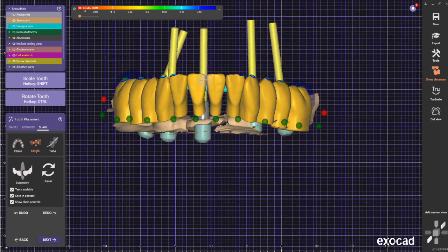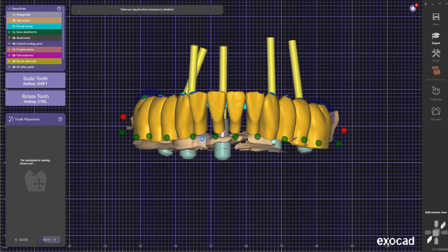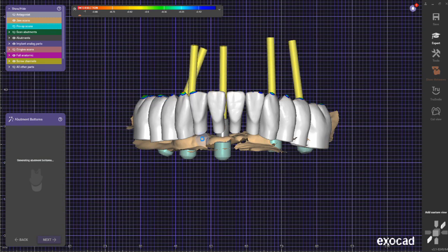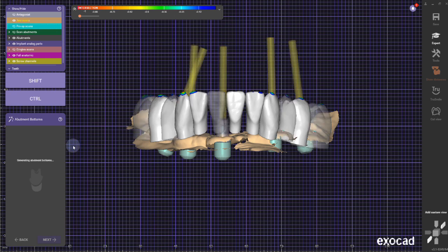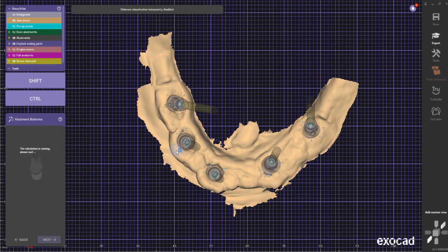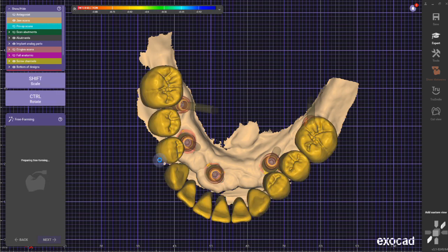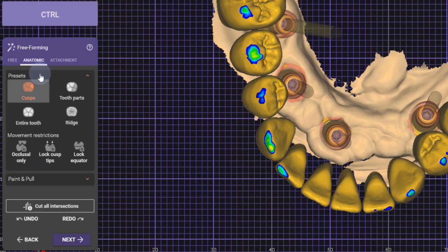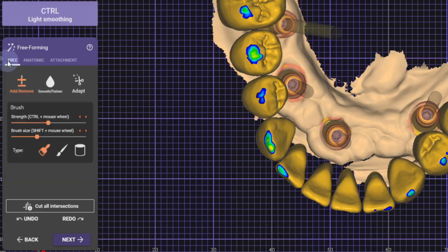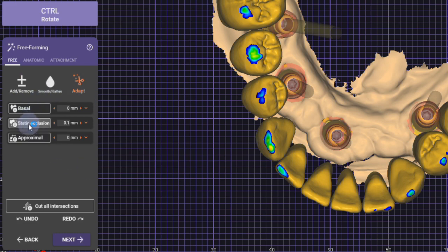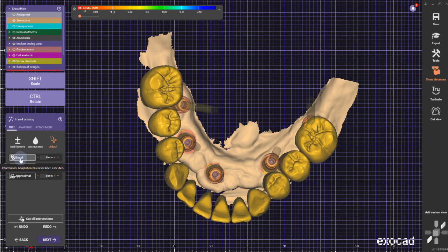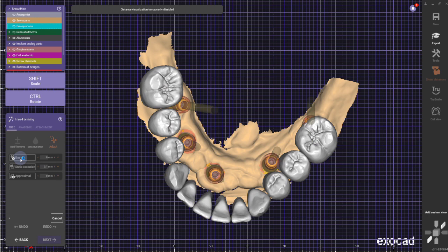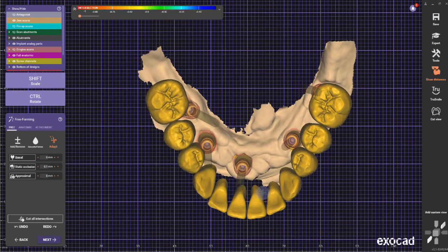The symmetry mode works really well if you want to design that really fast, so all the teeth are moving in the same position. Here I'm going to adapt the occlusion to the basal position, so I'm going to cut the contacts basically.